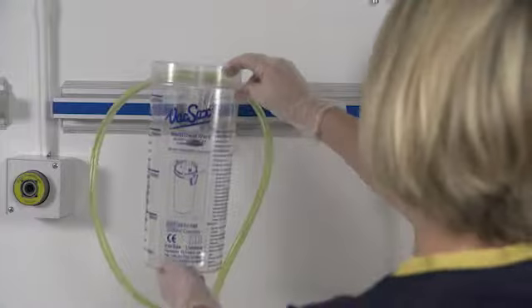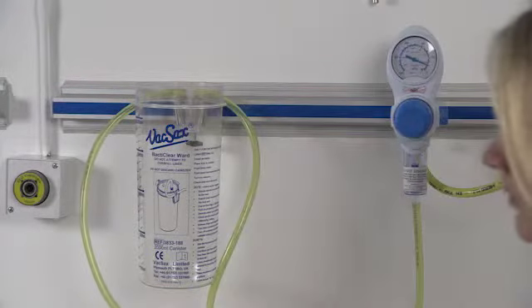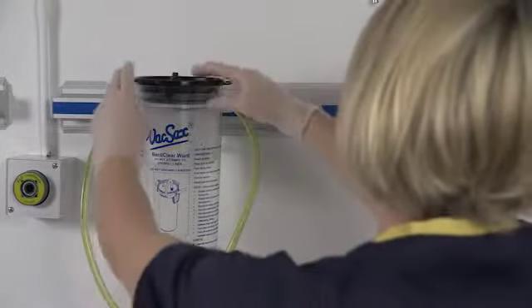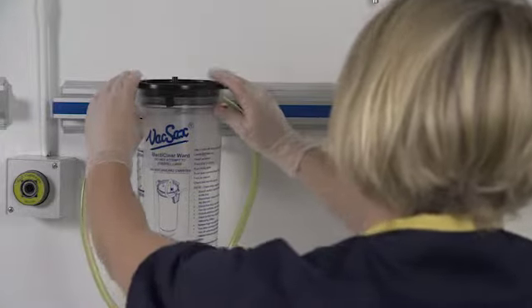Start by placing the 2.0L canister into the wall bracket. Place the Bacticleer liner into the canister and press home firmly.